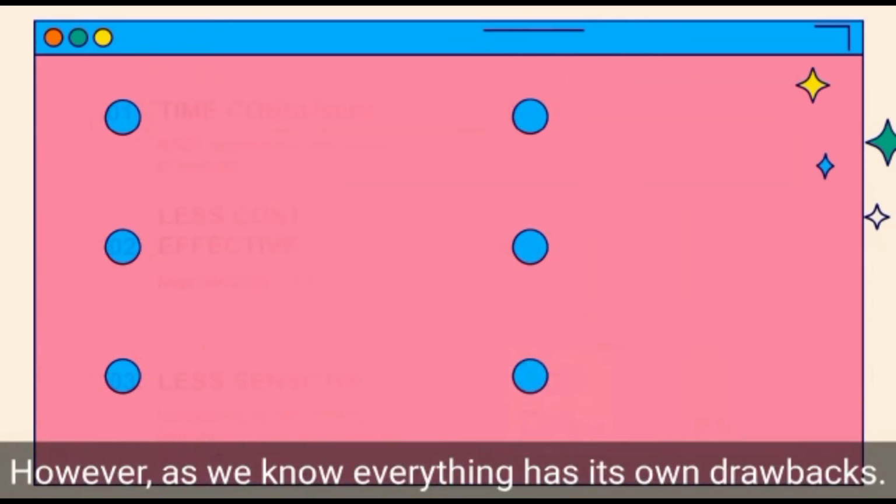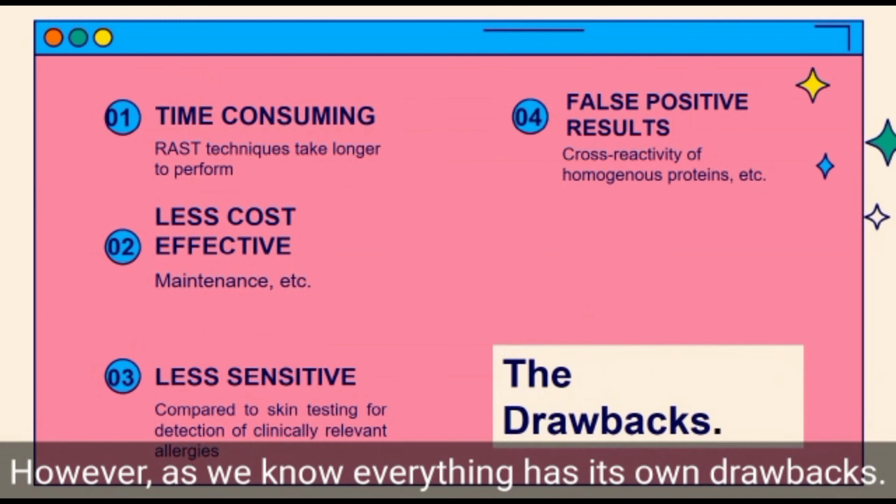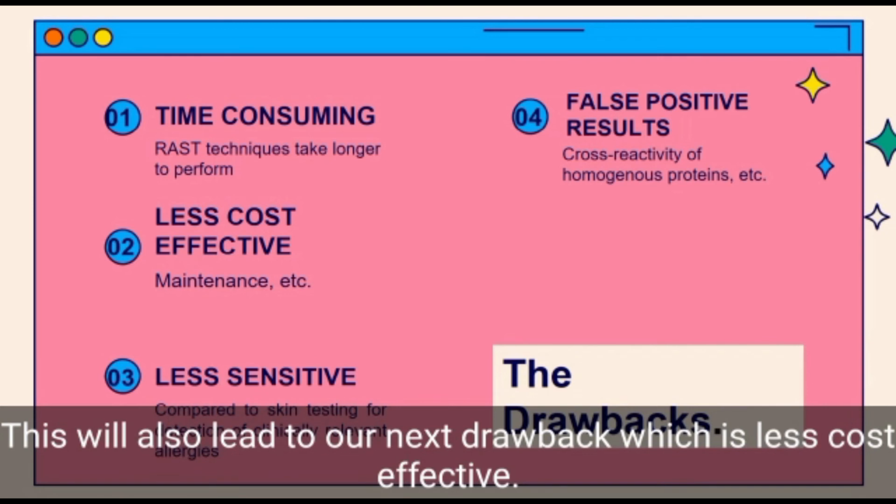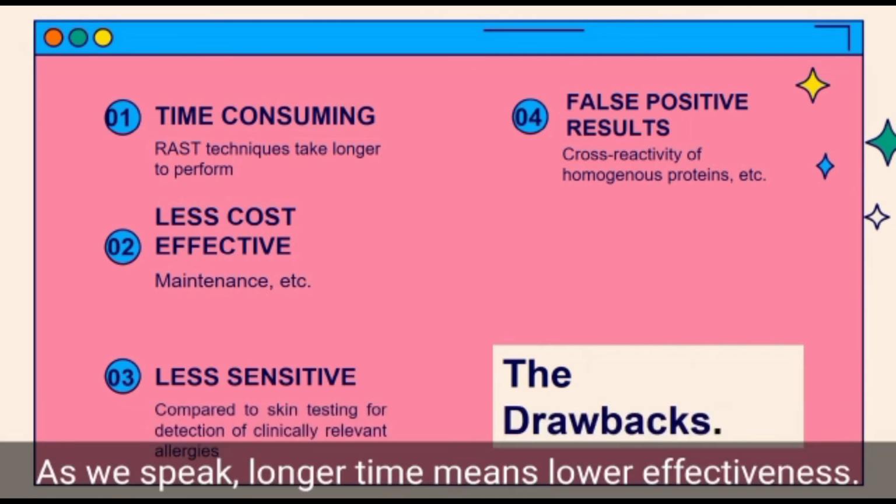However, as we know, everything has its own drawbacks. First, compared to skin testing, RAST techniques are very time-consuming and take longer to perform. This will also lead to our next drawback, which is less cost-effective. As we know, longer time means lower effectiveness.